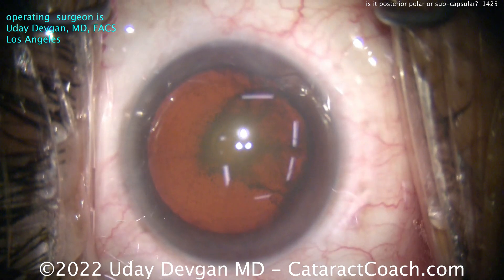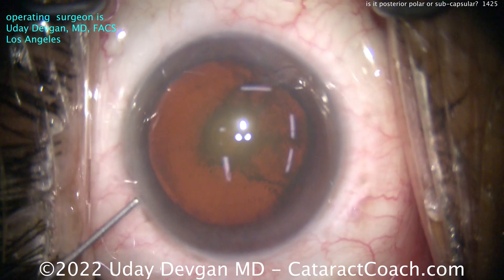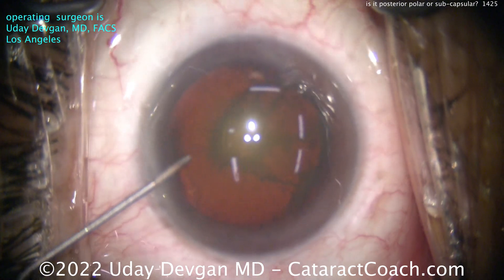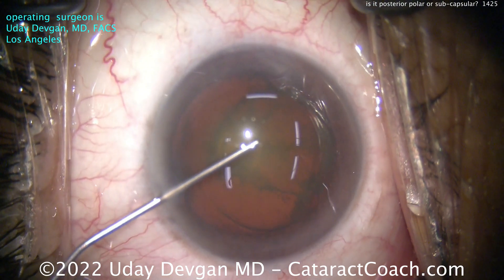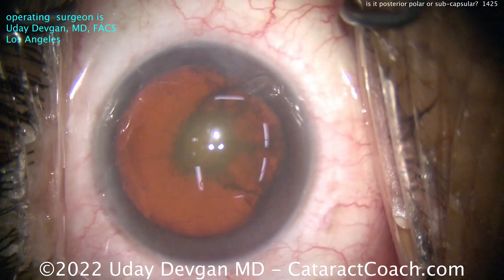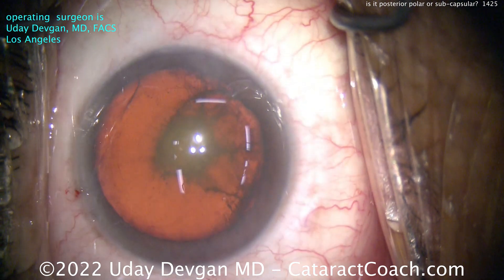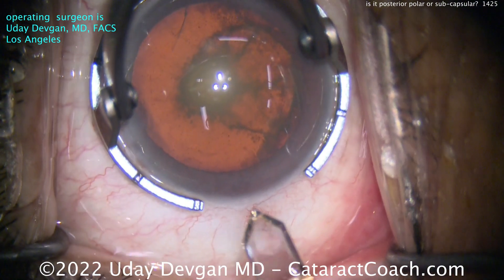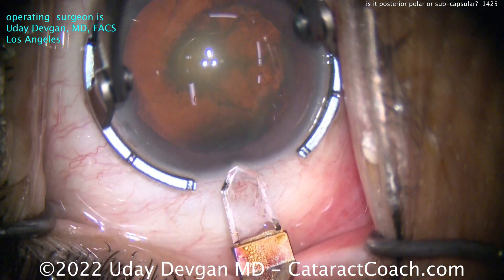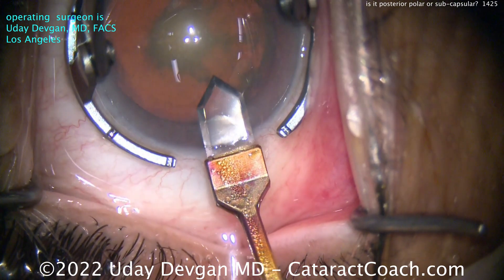Here's a thing that really confounded me. I look at this patient, I look at that red reflex, and I think — is that just posterior subcapsular or is that posterior polar? Both eyes look like this. The patient is not the best historian; can't really tell you if they were ever told they have posterior polar. All you know is what you see. Patient's about 60 years old, obviously comes in with bad vision. You see that big central posterior opacity — what is it?